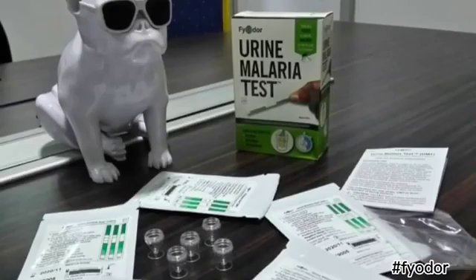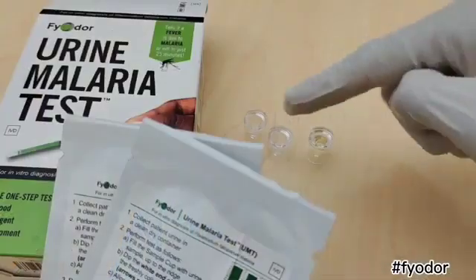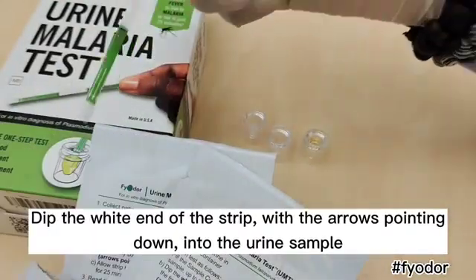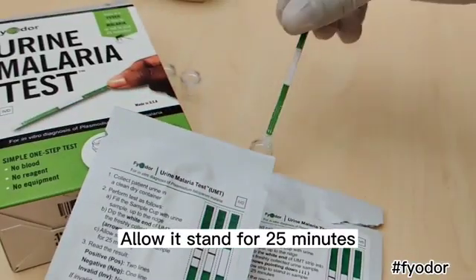Once you have the test kit, which you can get from nearby pharmacy stores, you can conveniently test for malaria in the comfort of your home, office, or wherever else you wish. All you have to do is collect a fresh urine sample into one of these cups, dip the white end of the strip with the arrow pointing down into the urine sample, and allow it to stand for 25 minutes.